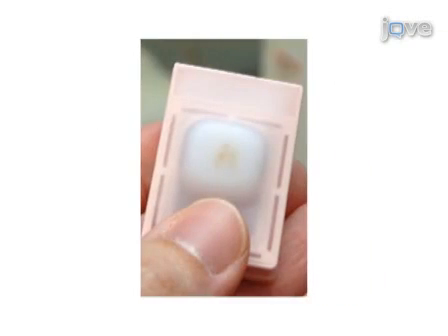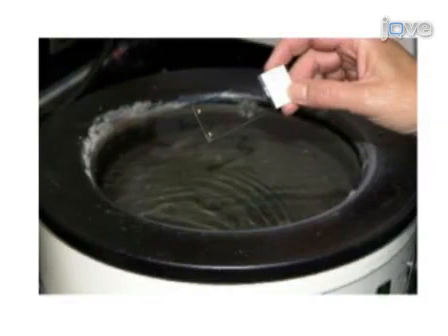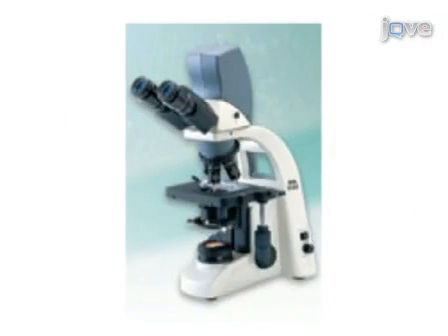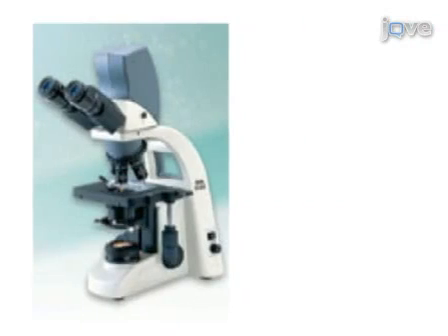After formalin immersion for 4 hours, these tissues are transferred to 70% alcohol overnight, followed by embedding in paraffin blocks. The second step of the procedure is to cut tissue sections from the blocks and transfer them onto microscope slides. The third step is to immunostain the tissue sections for possible proteins of interest using a sequenza rack. The final step is to view the tissue sections in a photomicroscope.